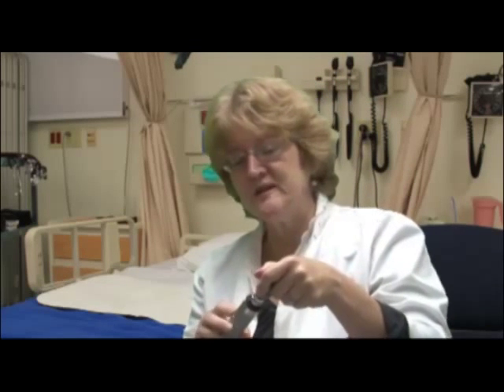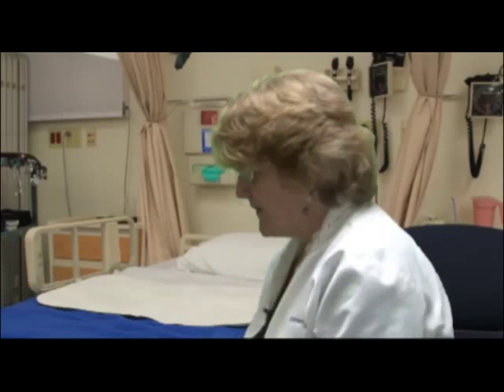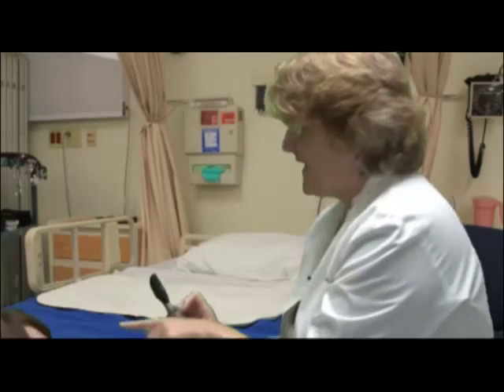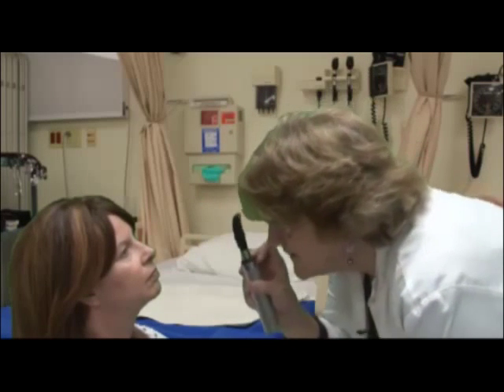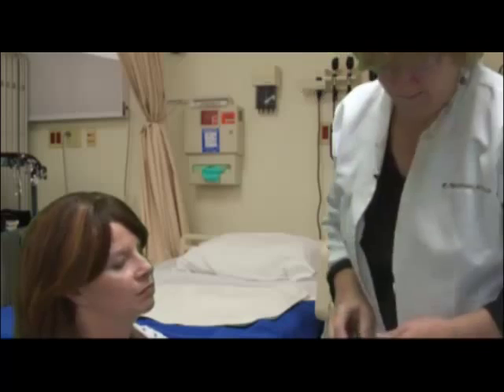Coming back to the eyes, I told you the only thing you'd have to do was the pupillary light. You will also look for the red reflex. To do the red reflex, you do need the ophthalmoscope. You'll need to turn it on, and then you'll be looking through the ophthalmoscope at her pupil, and you will look for a red reflex on each side.